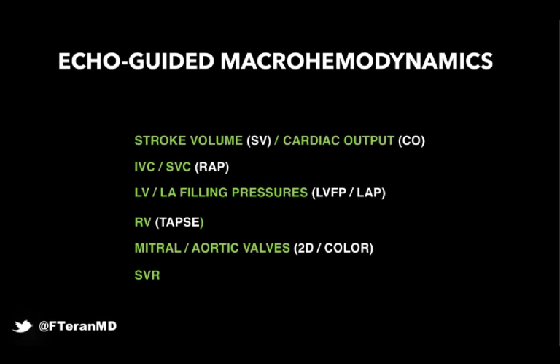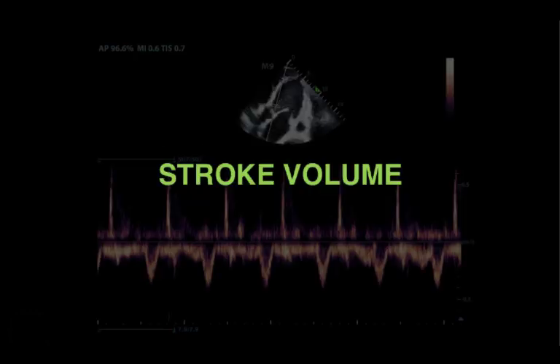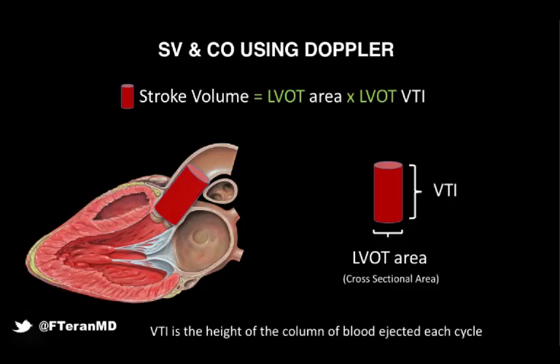And finally, we're going to actually do a qualitative assessment of the valves that, as you'll see, is fairly simple. We're going to end by assessing the SVR, basically simply integrating a formula. So stroke volume, this is the meat here.